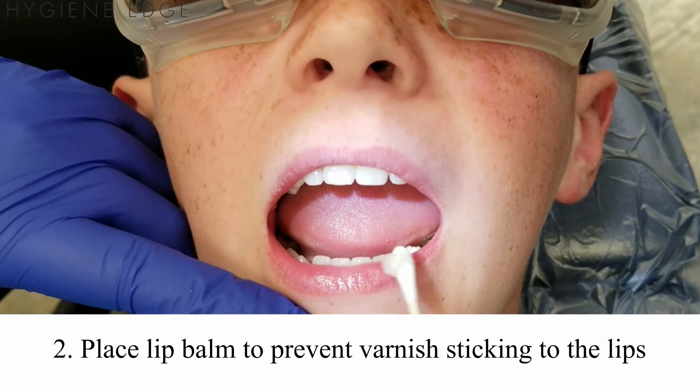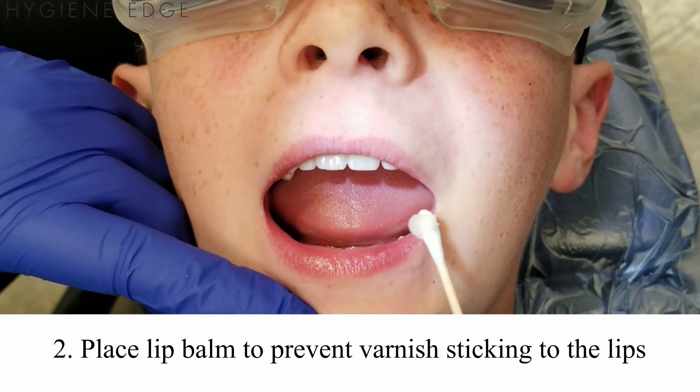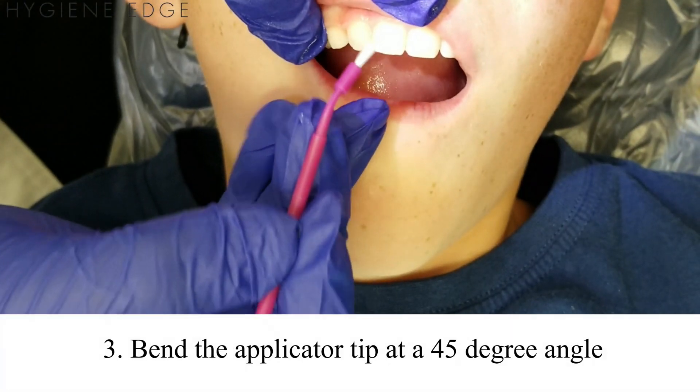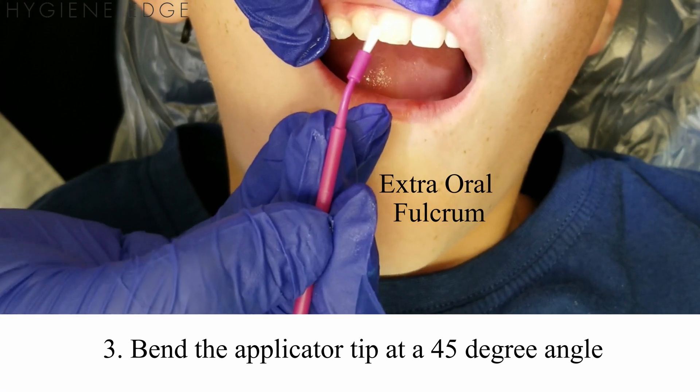Place chapstick or Vaseline on the lips to prevent varnish from sticking unnecessarily to the lips all day. Always bend the applicator tip at a 45-degree angle to help with adaptation, and use an intra- or extra-oral fulcrum for stability.